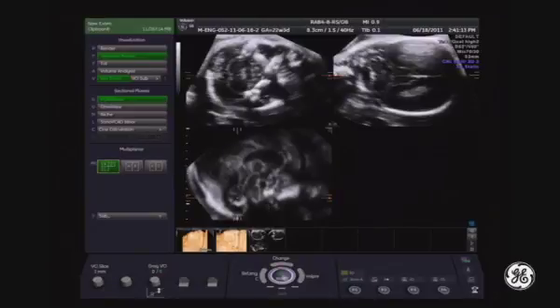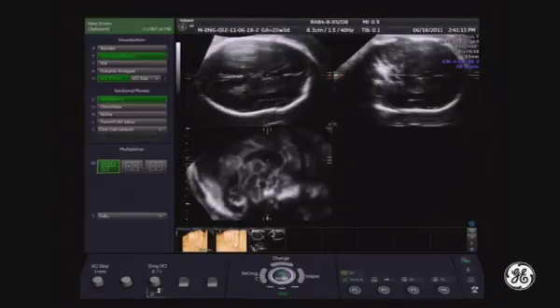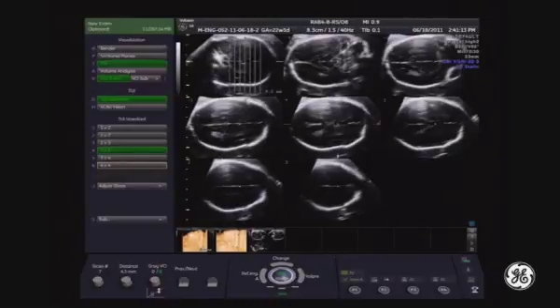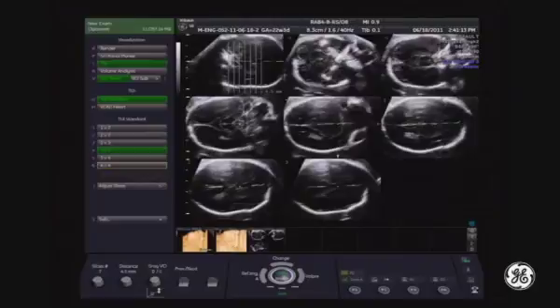Same you can do with tomographic imaging. I will bring my pivot point to the level of cavum septi now, and then I will make the tomography of axial view. I need to change my reference image to A, and then I will do tomography. Here, by changing the distance between the slices, you can present all the major views across the brain. You can navigate with this.